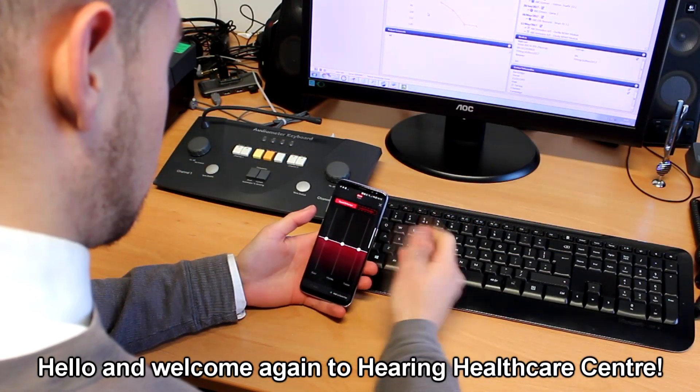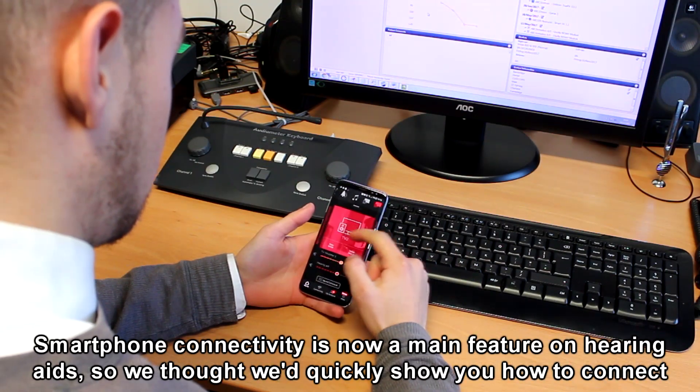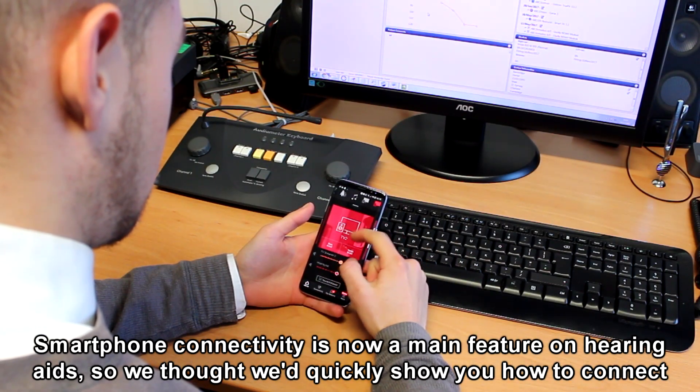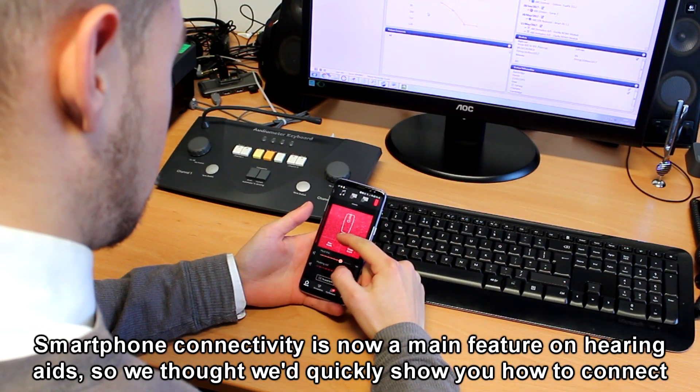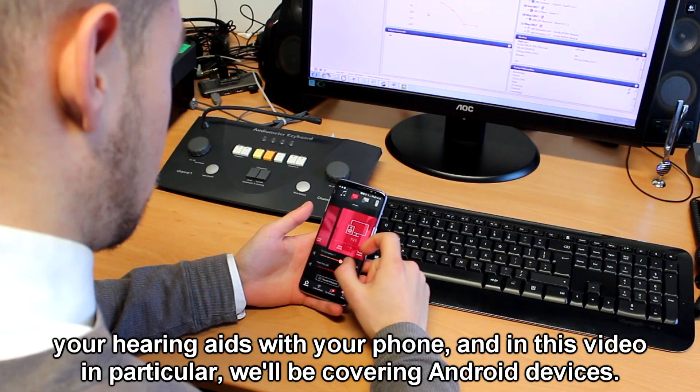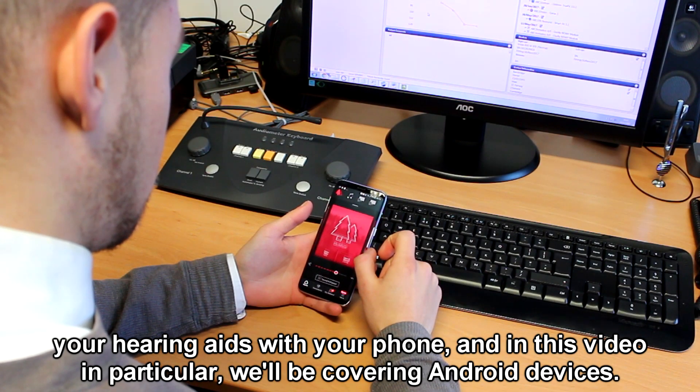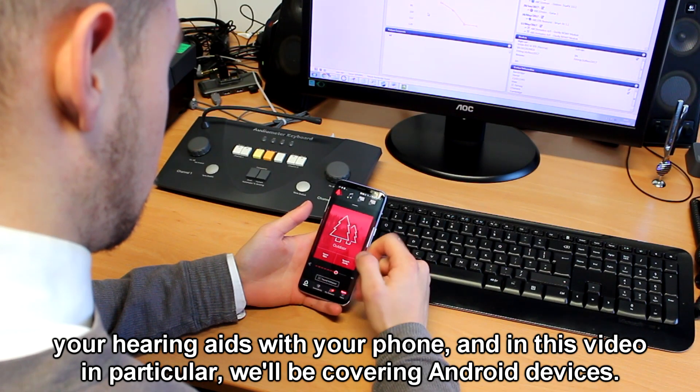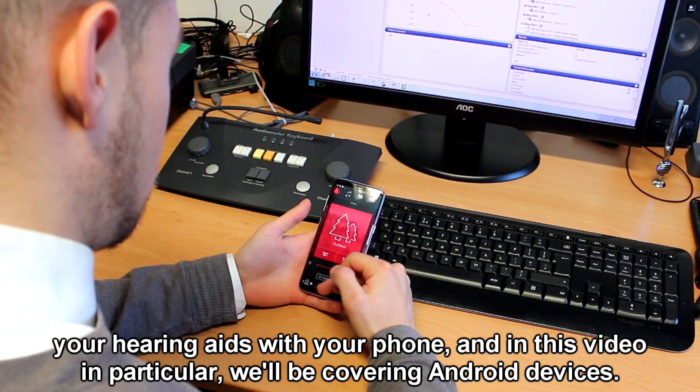Hello and welcome again to Hearing Healthcare Centre. Smartphone connectivity is now a main feature on hearing aids, so we thought we'd quickly show you how to connect your hearing aids with your phone. In this video in particular, we'll be covering Android devices.